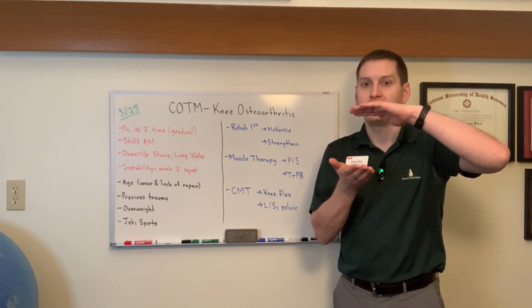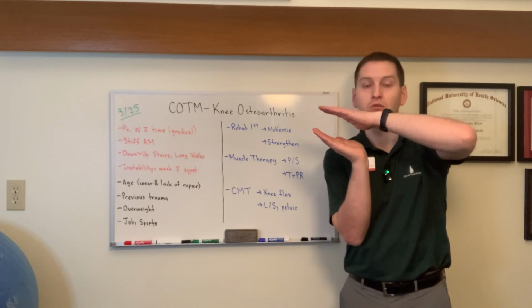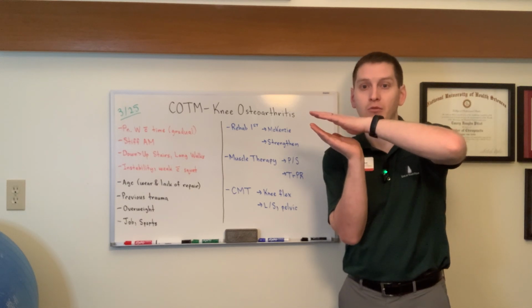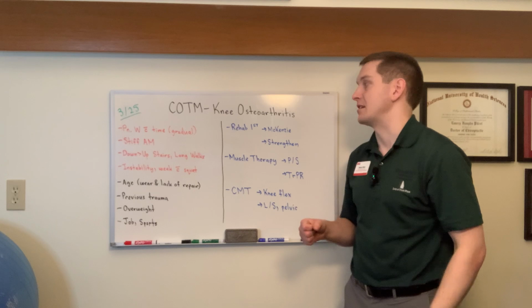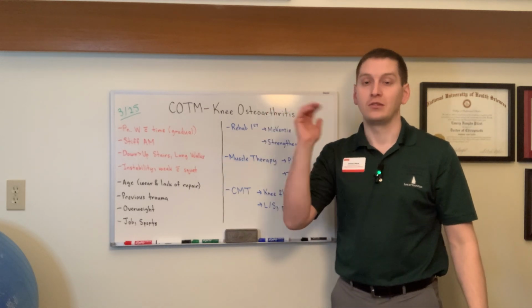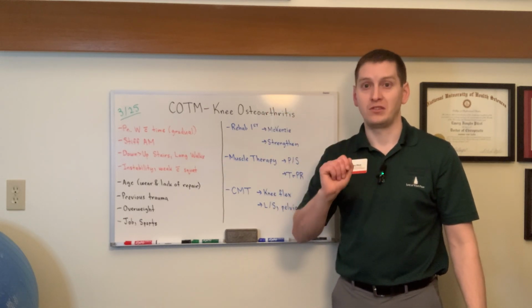And then the last is you'll see that instead of being this nice, healthy, uniform joint line, there is narrowing and sometimes non-uniform narrowing. So those are the three big signs that would then tip off a physician to look at an x-ray and say, hey, you have osteoarthritis.